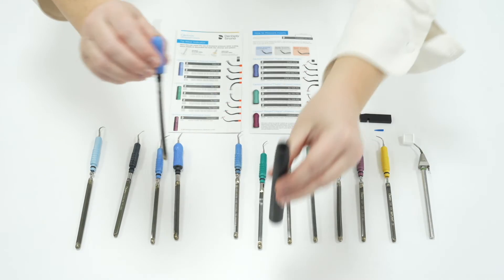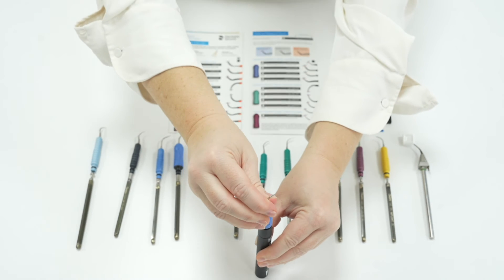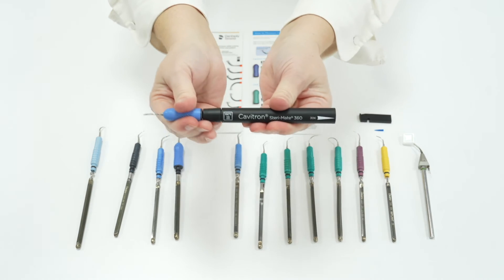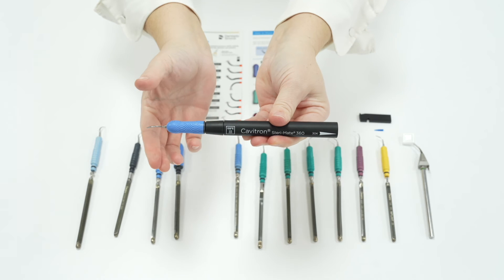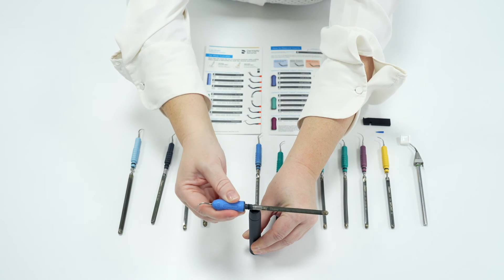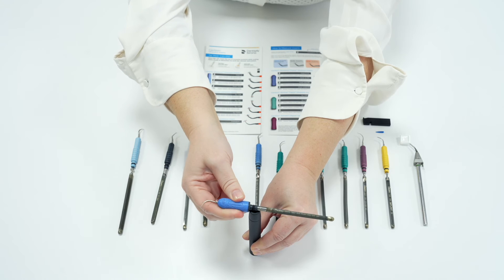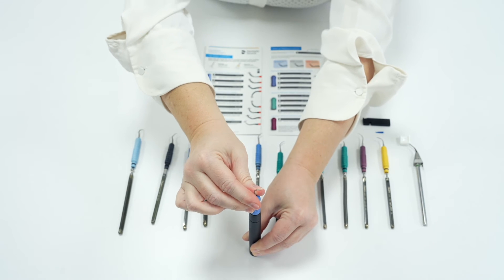A Cavitron insert should simply drop into the Stereomate and click into place. The other really important thing to know about Cavitron insert maintenance is that the Stereomate must always be filled right to the top with water so that there is a bubble of water sitting on the top. Then wet the insert O-ring and drop it in vertically, and a small amount of water should spill out as the insert drops into place.